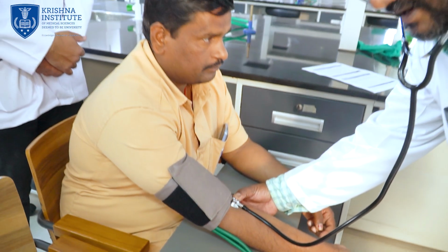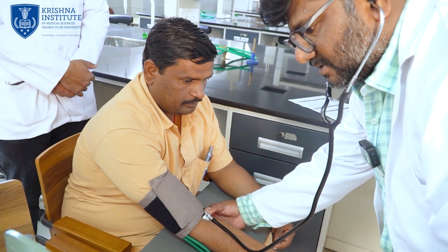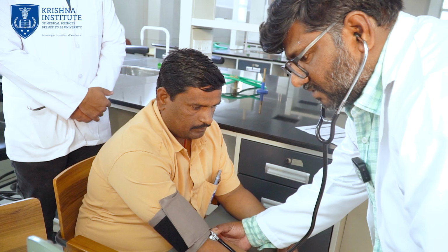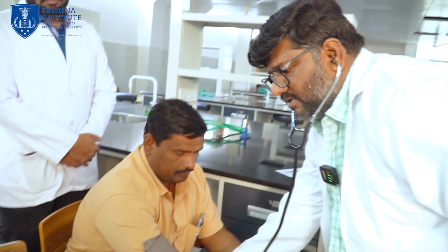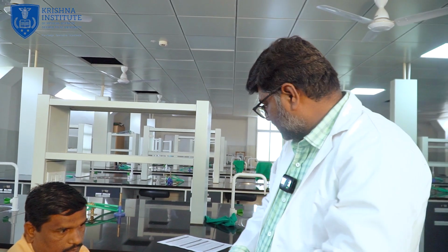Go on deflating the cuff slowly and note the fifth Korotkoff sound, where the sound disappears. That will be your diastolic blood pressure. The first sound will be the systolic blood pressure and the fifth sound will be your diastolic blood pressure. After the fifth sound, the sound will disappear.